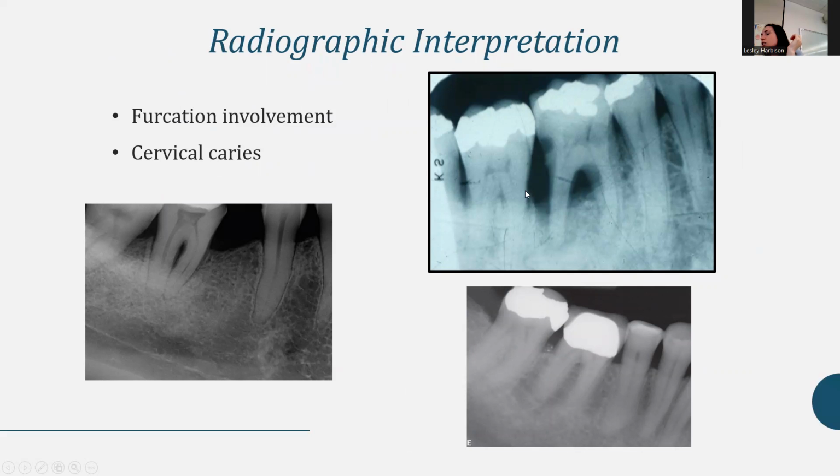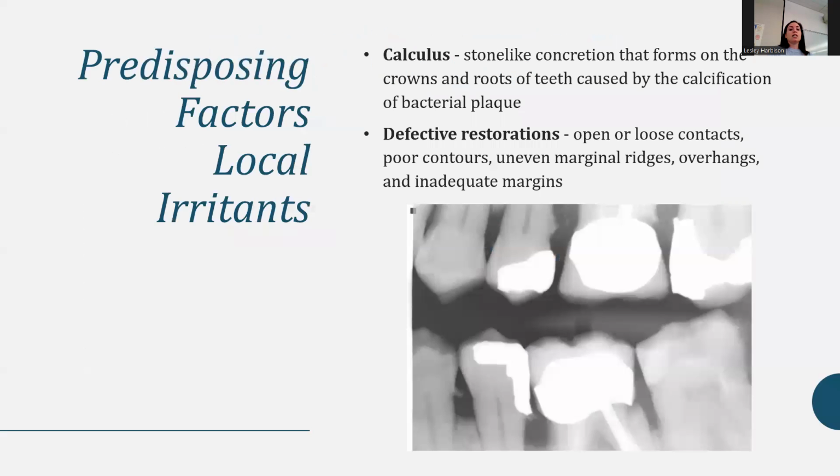So this to me looks like there's some vertical bone loss either in the facial or the lingual, because you can see sort of a faint line. Remember, you're looking through a plane of buccal and lingual. So there might be vertical bone loss on either the front or the back, and then the other side might scoop through and be more horizontal. The actual real anatomy of the bone loss can be tricky, but to me, it looks like there's some vertical there. I wouldn't test you on a film like that because it's not clear cut enough, but yes, I do think there is some vertical bone loss there.